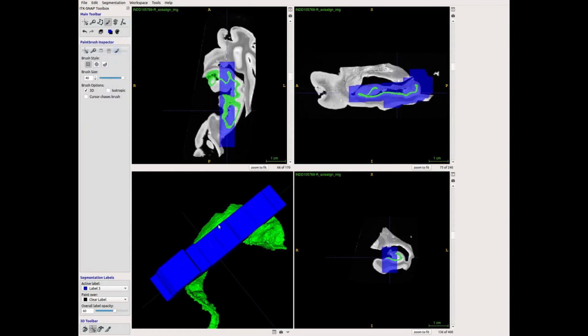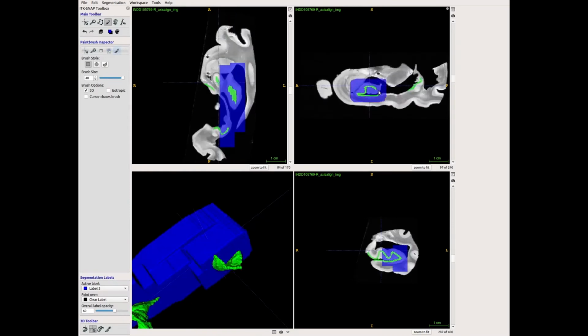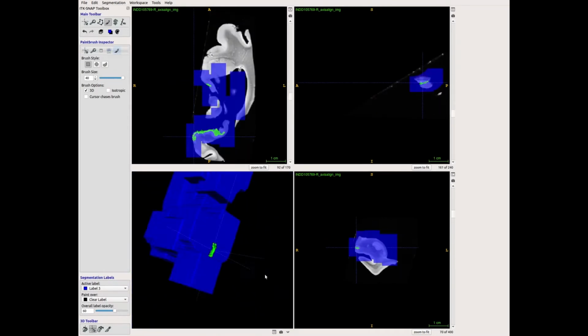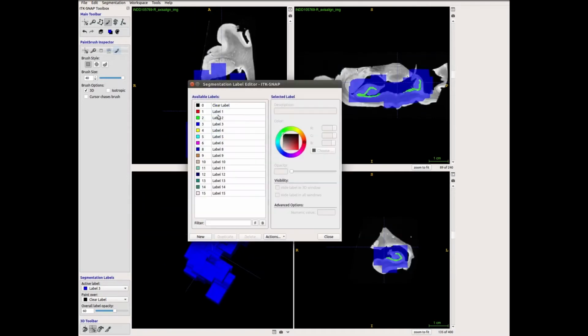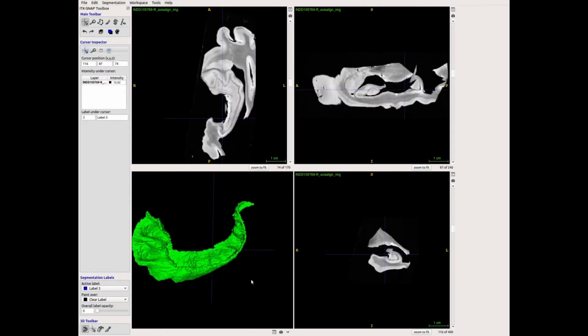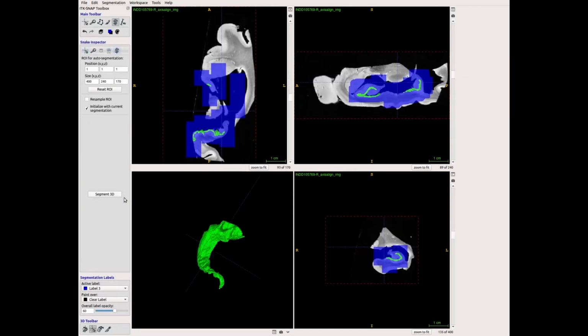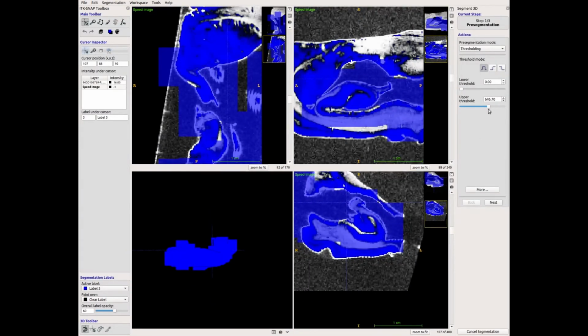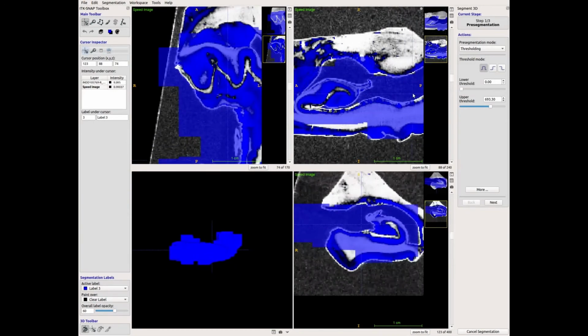What I'm doing here now is, so this tool doesn't have a simple way to just do pure erosion. So there I mostly just dilated this label out. But what I'm doing now is taking another label and I'm just going to dilate that over our first label in order to effectively have erosion. So I'm thinning the dark band by thickening its surrounding label now.